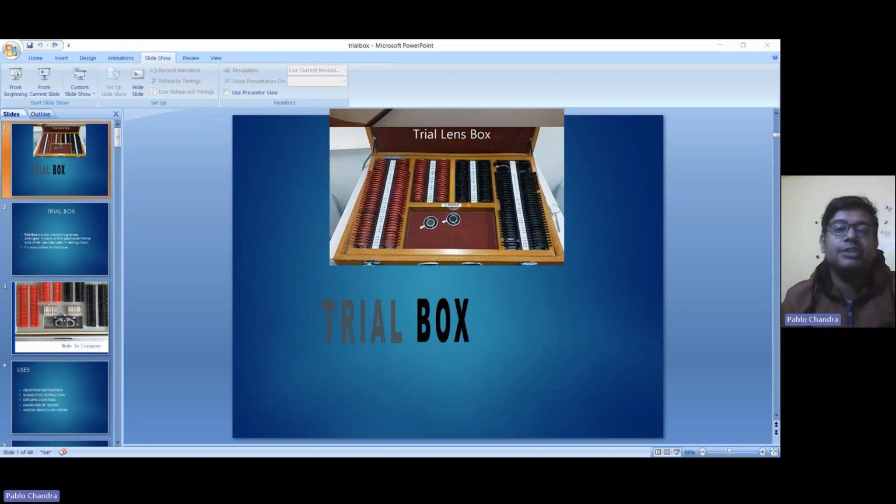Next point is the exercising prism. The main function of prism is the correction of the squint, to measure and to correct by exercises, by giving it in the spectacle or as loose prisms. It can be used in various ways for training the patient, in correcting the squint, and also for improving the angle of the eye.